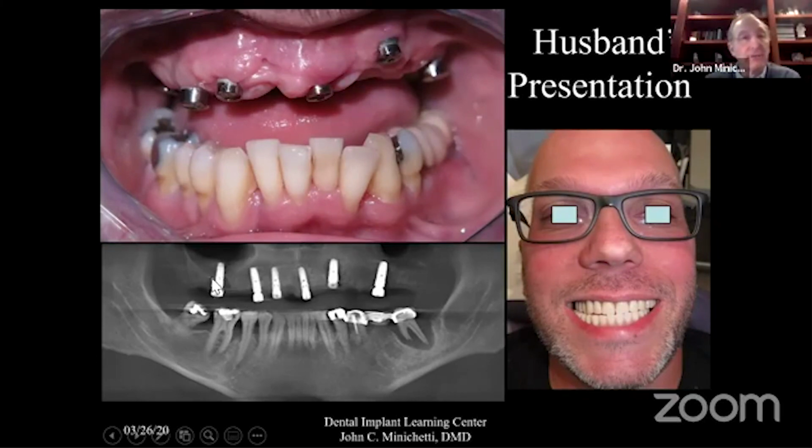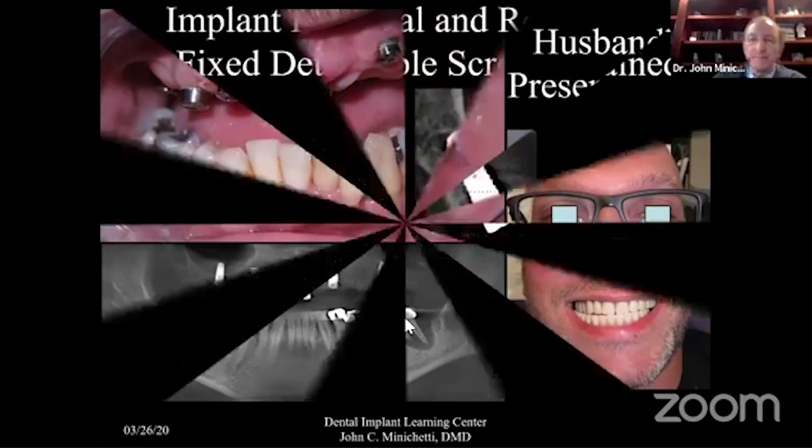There's absolutely no bone in this sinus lift type of procedure, with a crater around it, and a facially placed implant that maybe we could re-angle for a fixed prosthesis after doing a diagnostic wax up if this were in the proper position. But on examination of this area, you're going to see that there's actually no facial bone on this implant. He also has a severe periodontitis case on the lower, unlike what's presented by his wife.